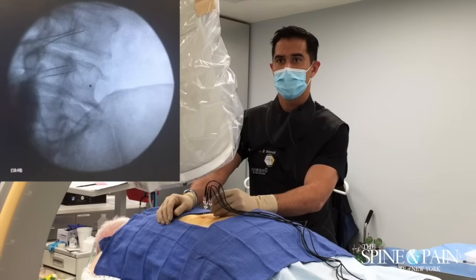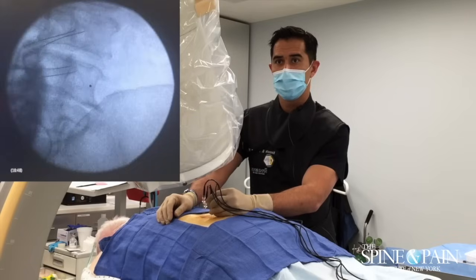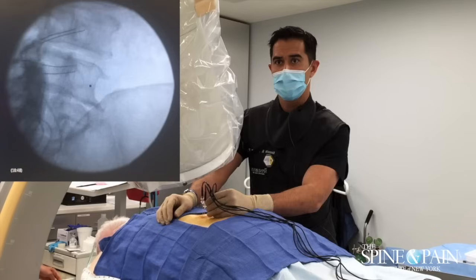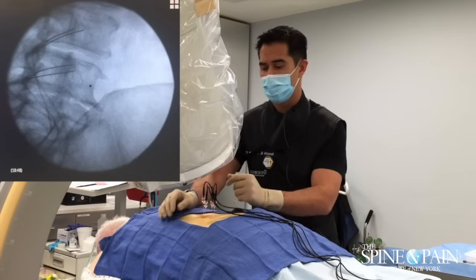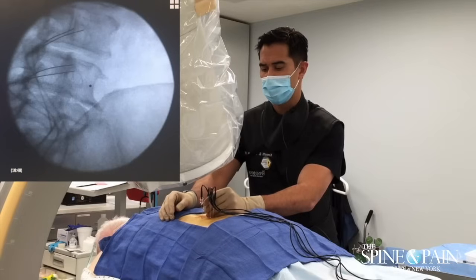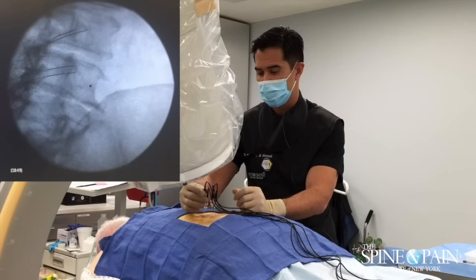We've gone oblique. We don't want to pass the anterior border — you want to be behind that line there that you can see. Looks good. Our needle tip is always on bone — that's on bone there.